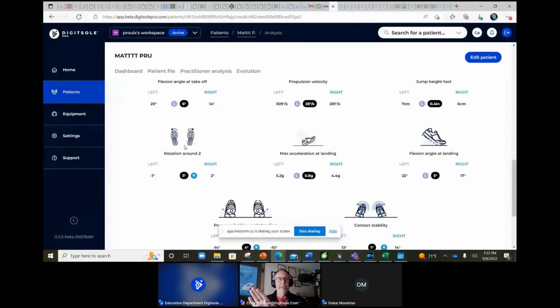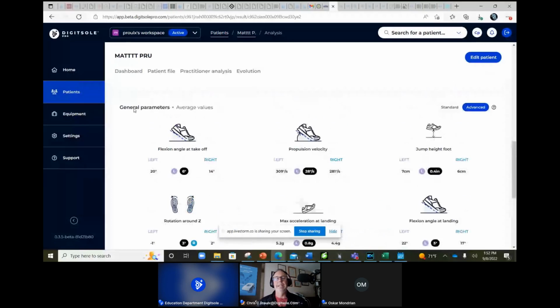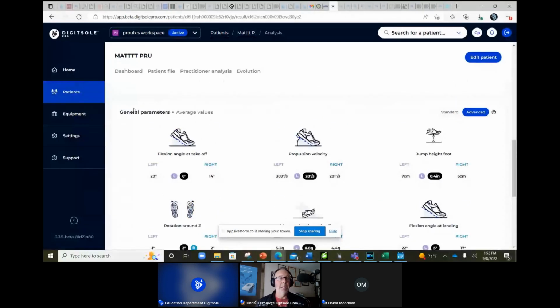Now, as you increase the degree of external rotation, especially on landing, that results in an increased valgus position of the knee joint, which puts them in a very risky position for an ACL injury, right? So now we're able to actually capture a lot more characteristics on very validated tests that otherwise we weren't able to accomplish. In addition to using the video, I also get the visual that I can either put into another system to look at some of the angles or just have a visual to be able to show the patients how they actually look when they jump or hop.